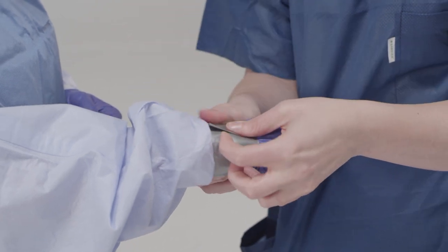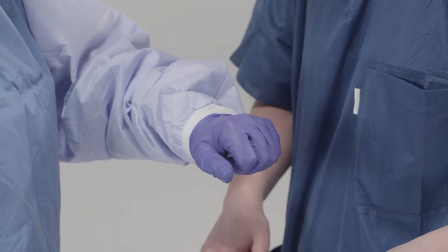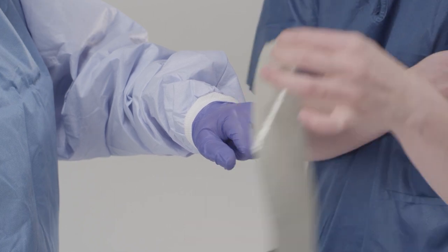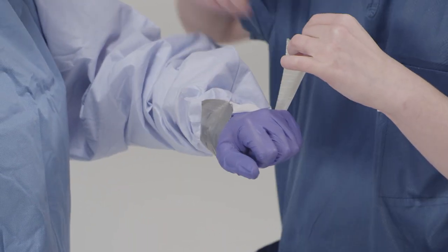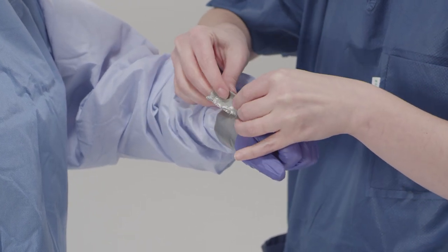If taping is used, a tab should be created by folding the tape over at the end. This tab will help facilitate easy removal during the doffing process. Care must be taken to remove tape gently. Experience from some facilities suggests that taping may increase risk by making the doffing process more difficult.